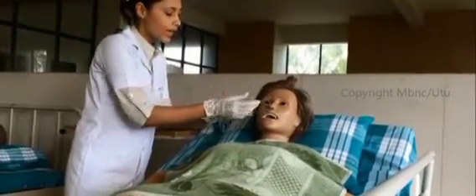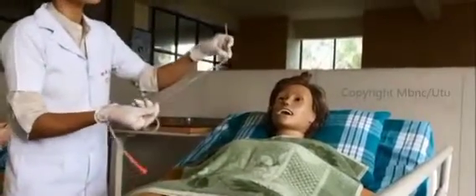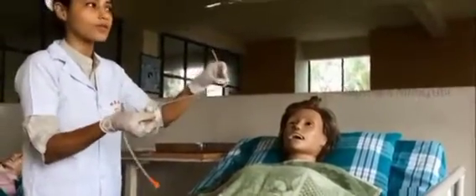It should not touch the patient's body, because it is sterile and it will go inside, so there is a chance of infection. So we have to measure from the tip of the nose to the earlobe, and from the earlobe to the xiphoid process. So that is the approximate length. It will show between 50 to 60. That will indicate this much we have to insert into the patient's nose.